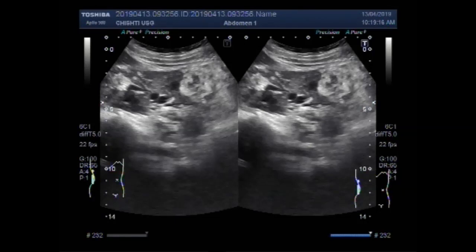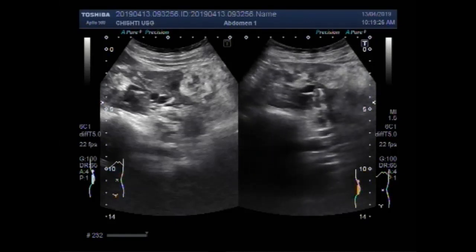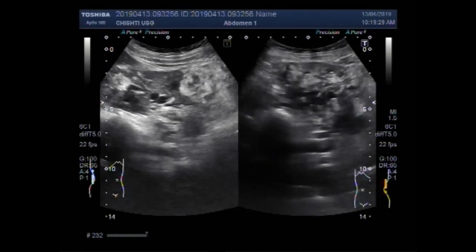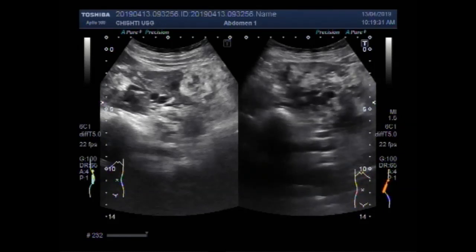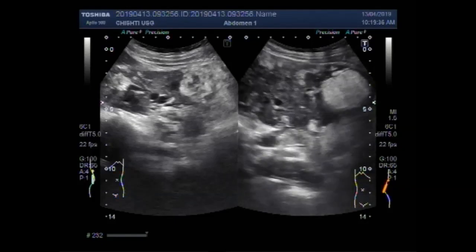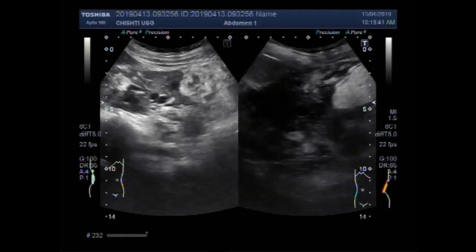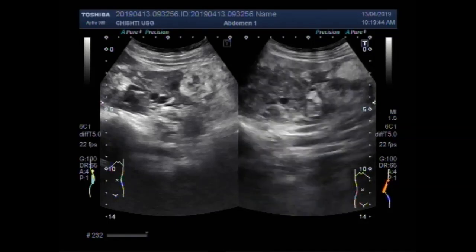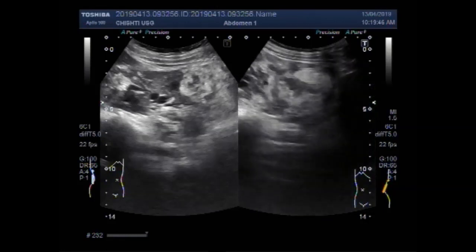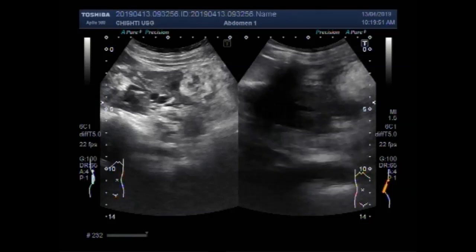Now you can see the left kidney. You can see a larger mass in the lower pole of the kidney, and multiple small focal regions are seen throughout the whole length of the kidney.